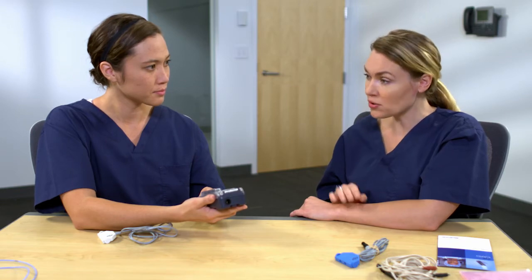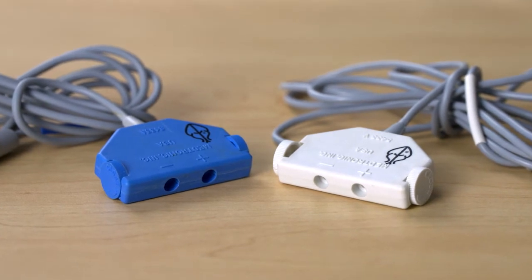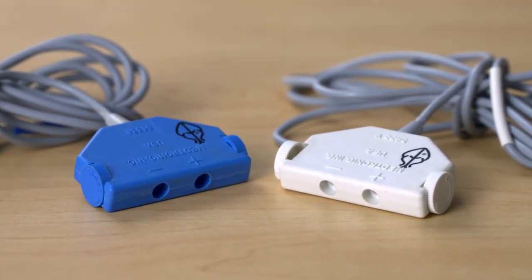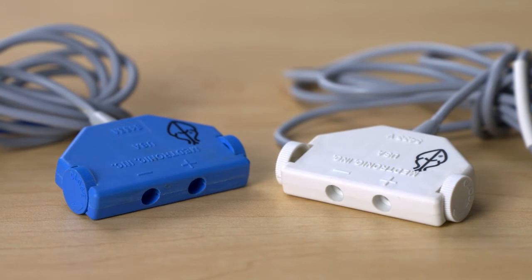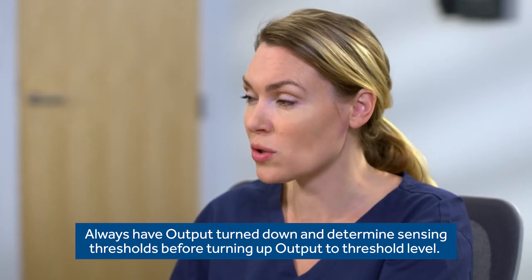Now let's talk about connecting the cables to the device. Do you know why there are two different colors for these cables? Isn't the blue one for the atrium and the white one for the ventricle? Correct. For more information on cables, you can use the cable compatibility guide, and we'll practice connecting the leads and cables to the device. While we don't have a patient today, there are some key points to remember. For the patient's safety, make sure the device will not capture when connecting the patient cable, so the output should be turned down so there is no capture. Now let's practice connecting the cables.